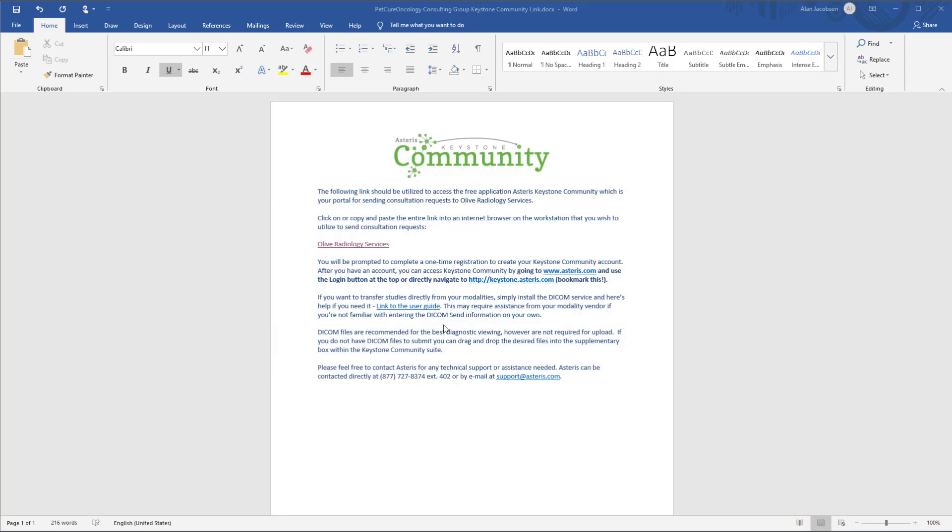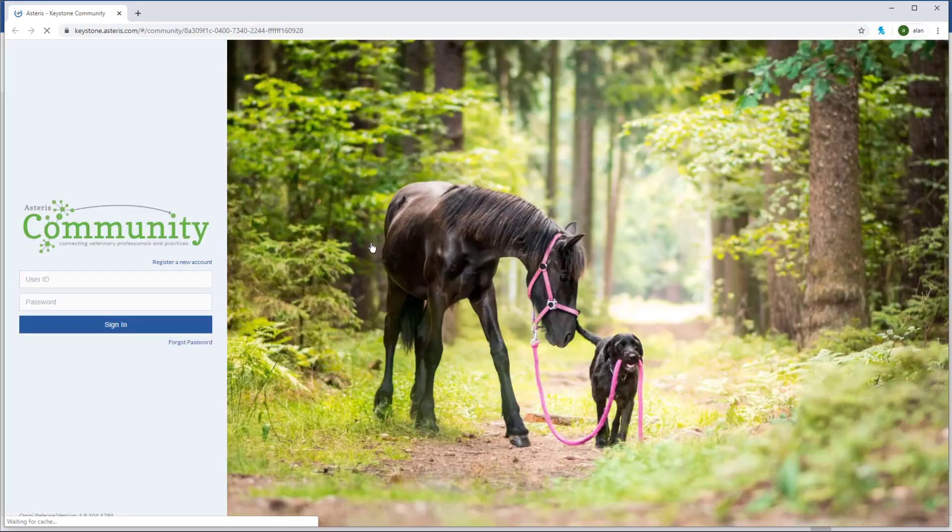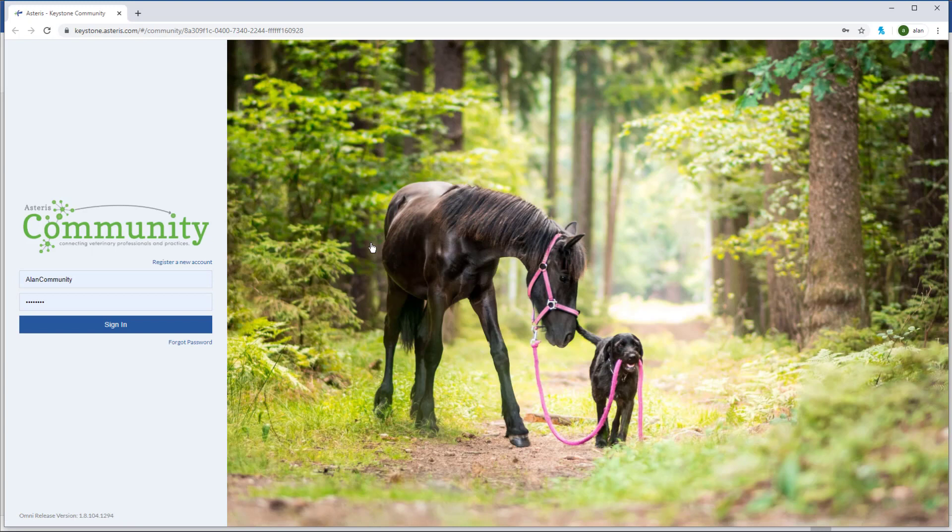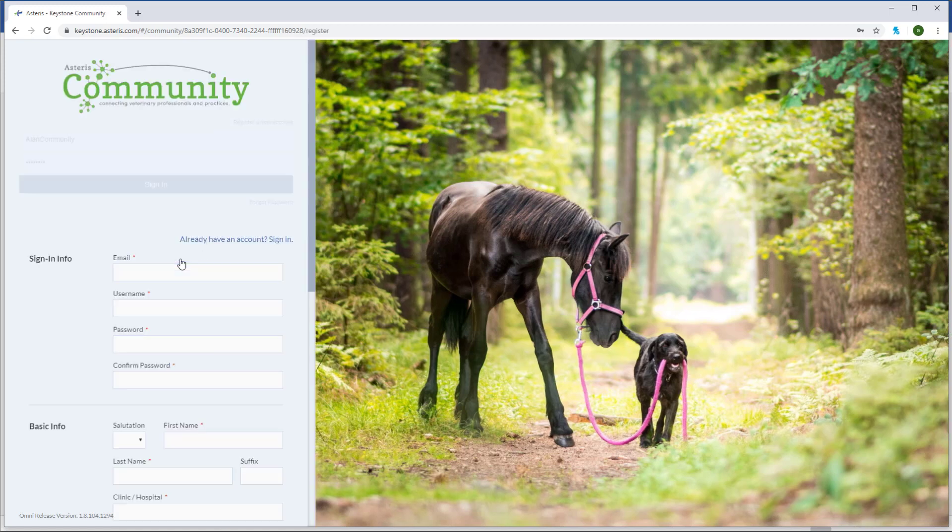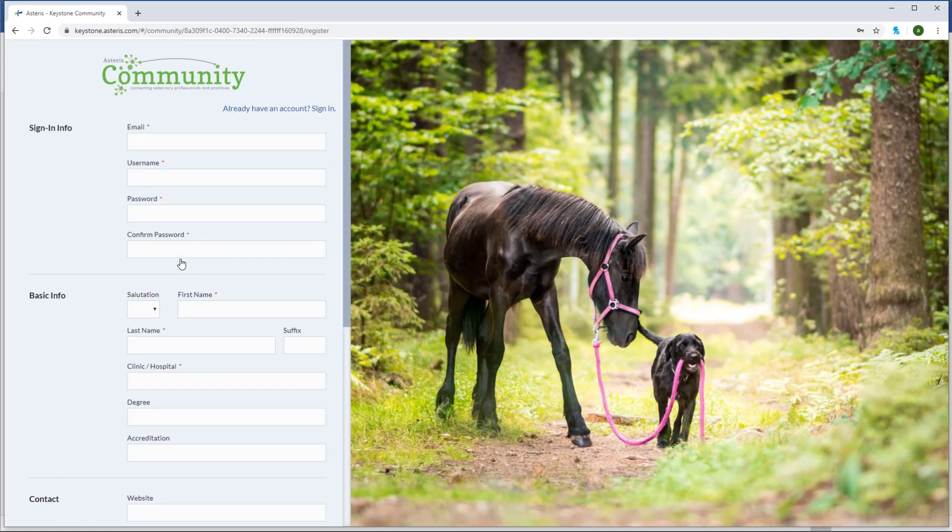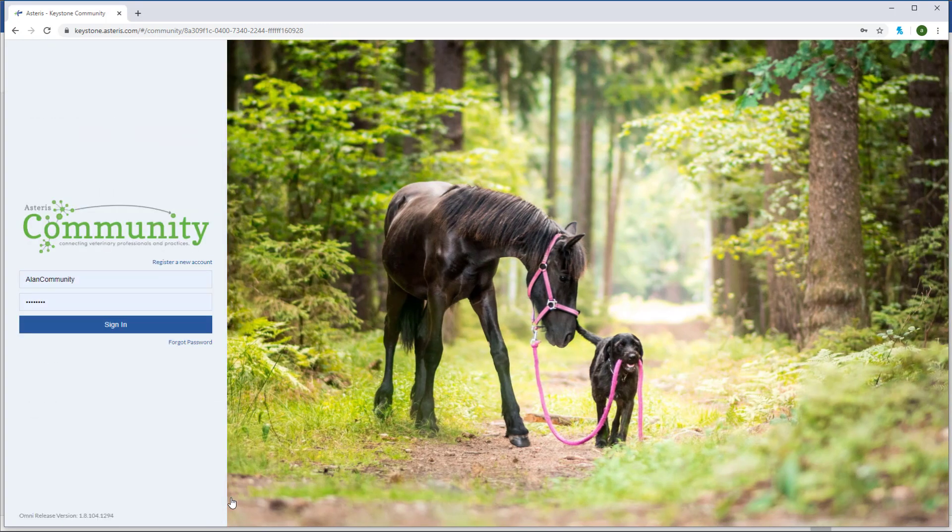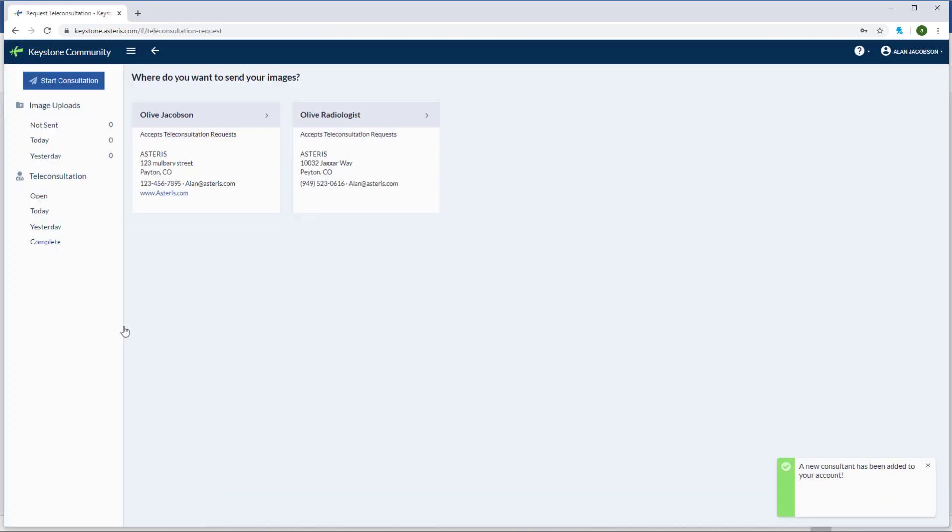The first thing you will need is a unique URL provided to you by your desired community specialist. The URL can be provided in multiple formats. What I have here is a template that Asteris provides to the consultant. To get started, click on the URL and you'll be directed to the Keystone Community web portal. You will need to create an account to send images. Click the register account and enter in as much information as you can. The red asterisk items are required to create a community account. Once you create an account you can log in and start sending images to your desired specialist.